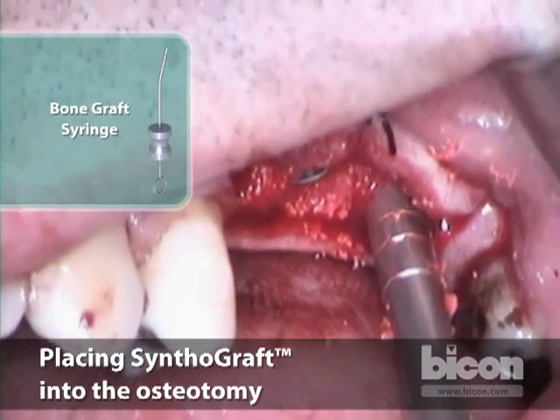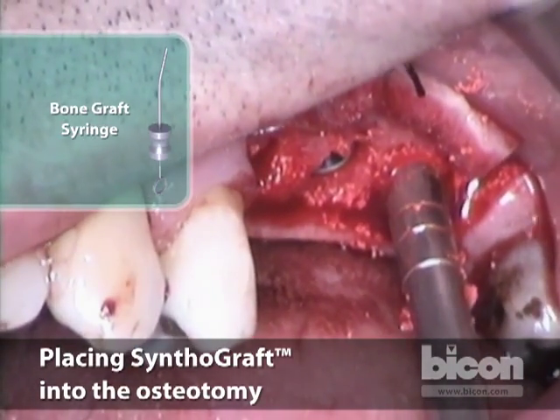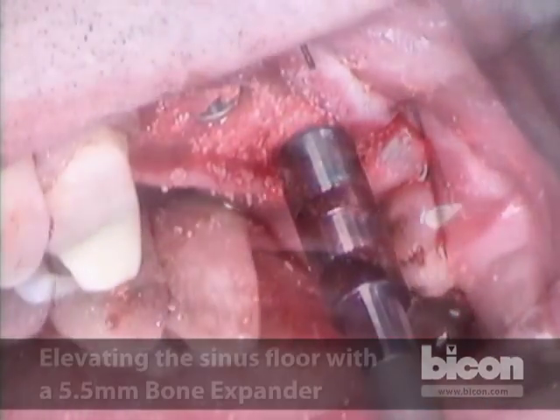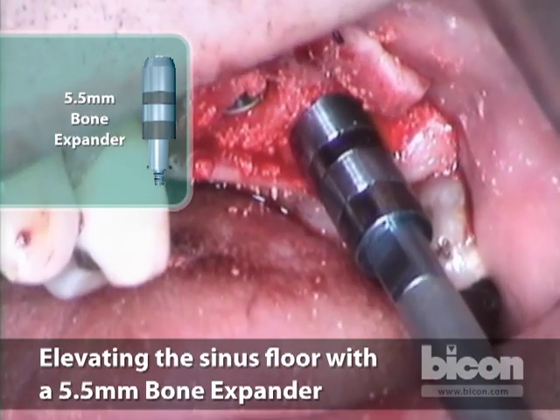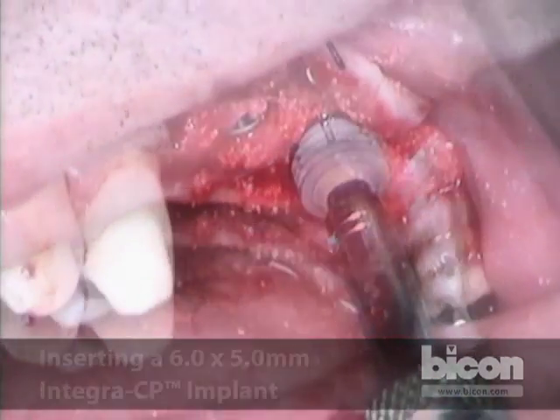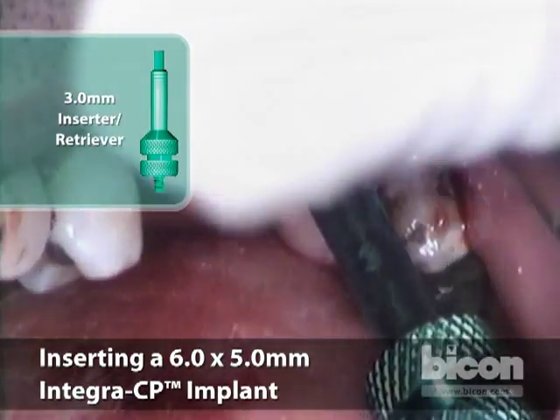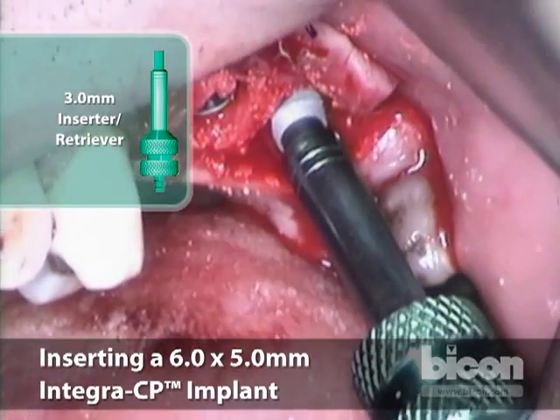Now again, we will pack the bone and start lifting the sinus floor. This is a side expander, and we will tap it in. Now I know that the bone has gotten in there. You can twist it a little bit — that allows some of the particles to escape.